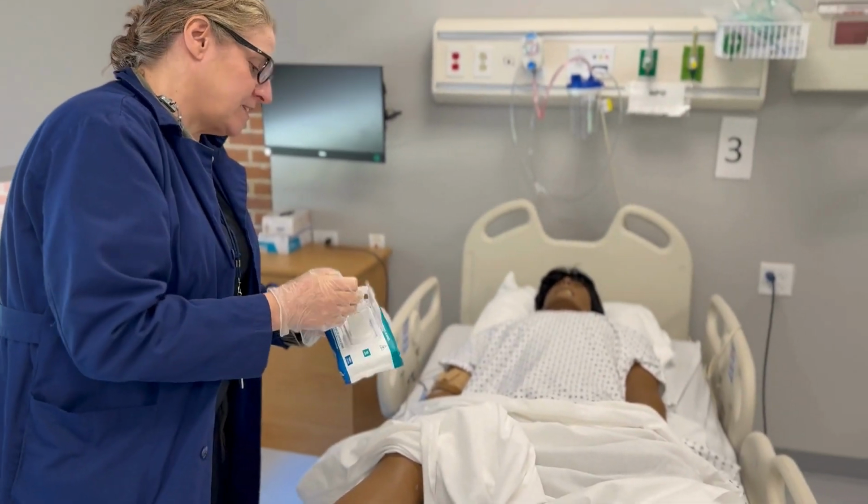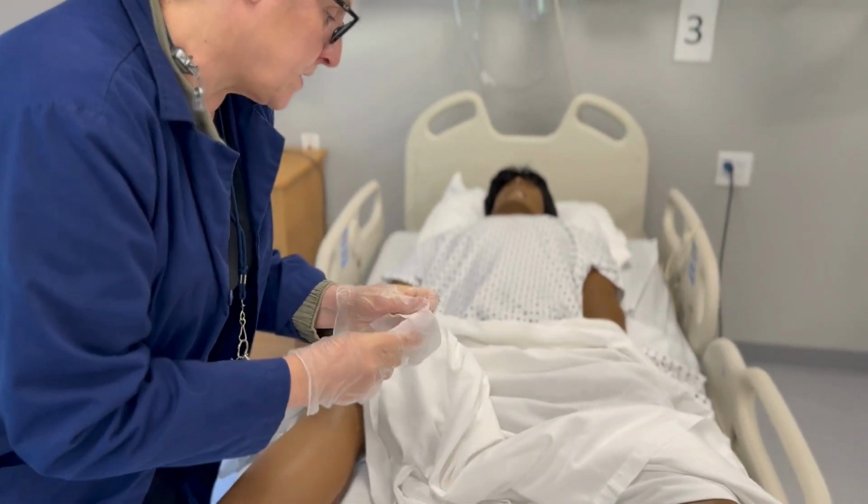Cleanse the genital area. Okay, I'm just going to clean you down here, Sydney, with some cold wipes. I'm so sorry.